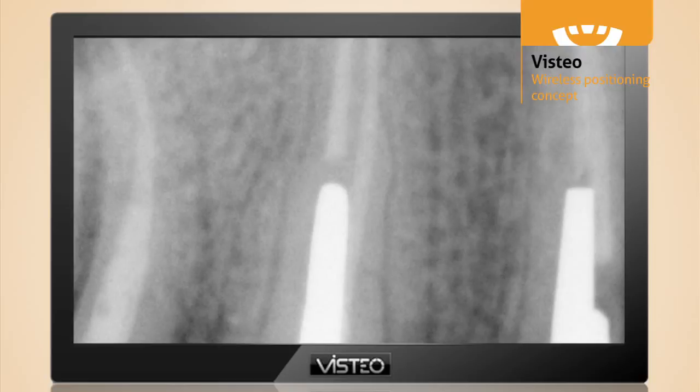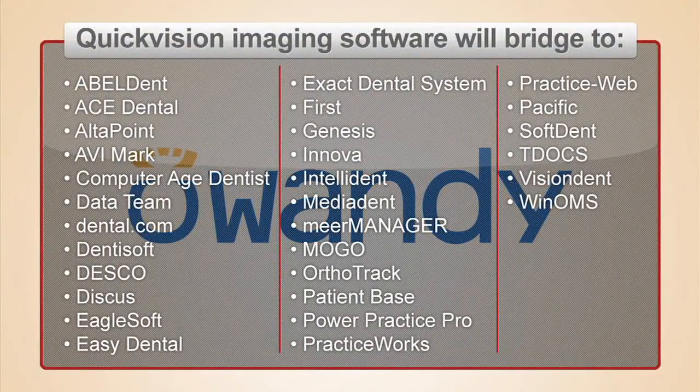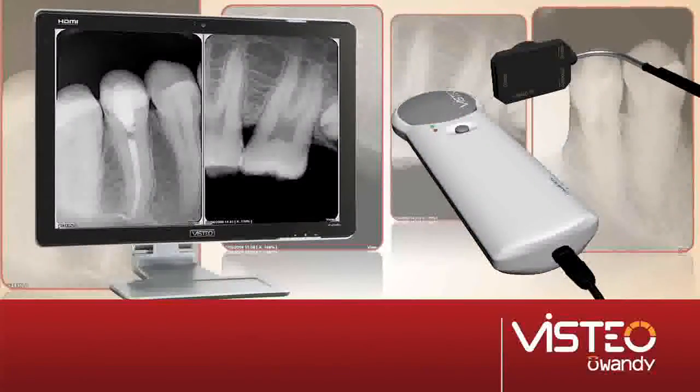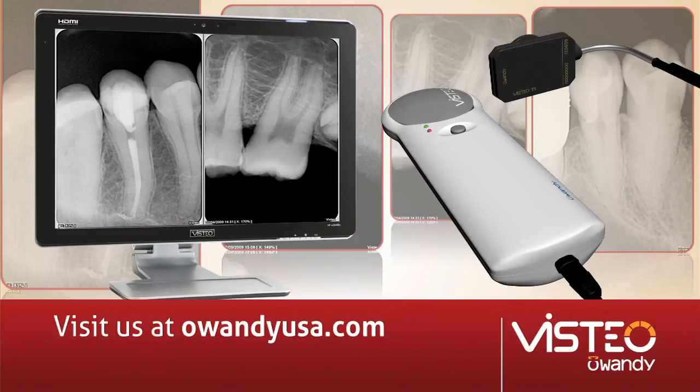This means you can view your crystal clear radiographs at full screen without image degradation, or zoom in without pixelation. Diagnosed with the state of the art in image quality. Owandy products integrate with all major practice management software available. For more information on Visteo sensors, please visit us on the web at owandyusa.com.